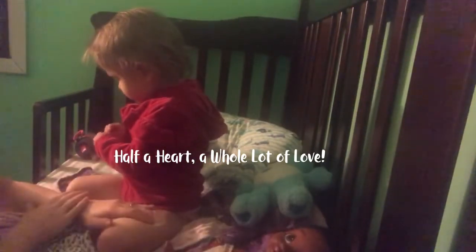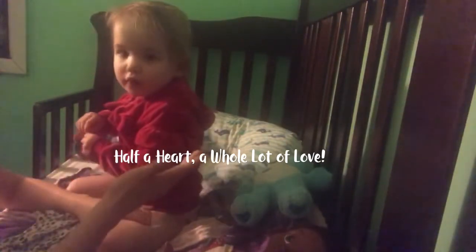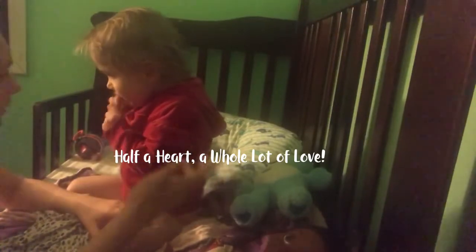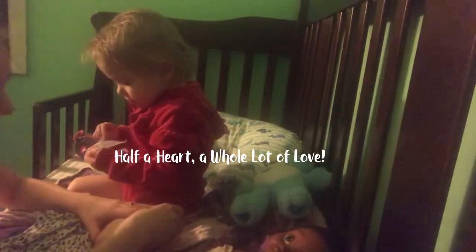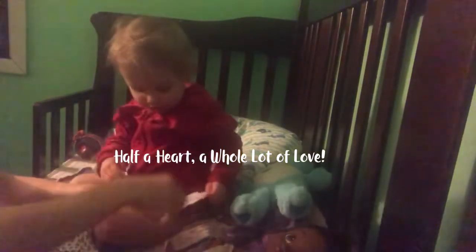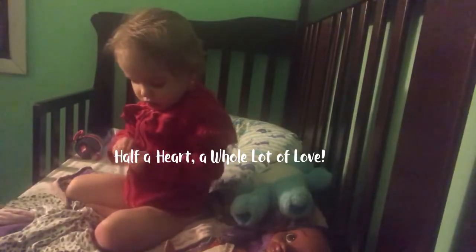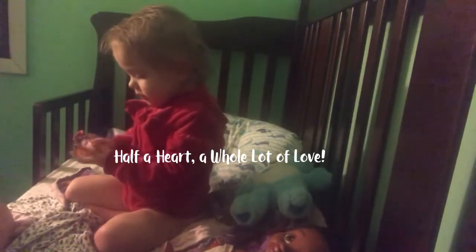So then you just push it down, and right then she might wake up. She'd probably wake up maybe if she did it all. Sometimes she would sleep through this, honestly. And if she'd wake up, she'd cry for a little bit, and then she'd go right back to sleep. She would cry for less than 10 seconds. And then you just open that up, and you're done. So I became a Lovenox shot ninja. That's what I tell people.